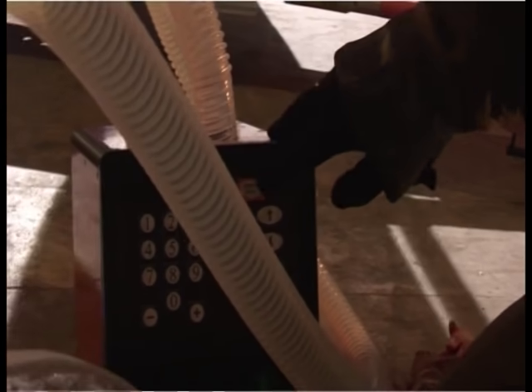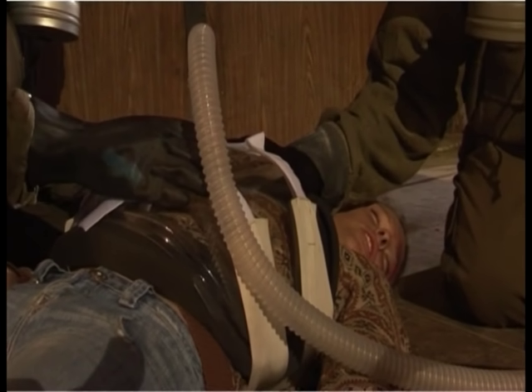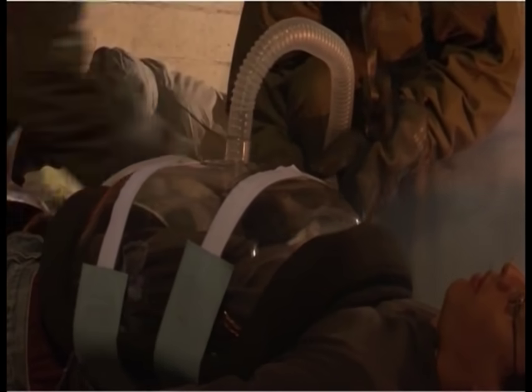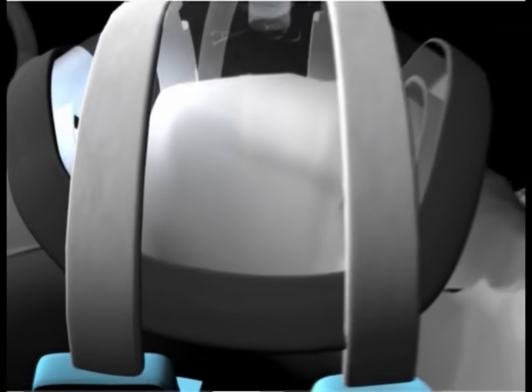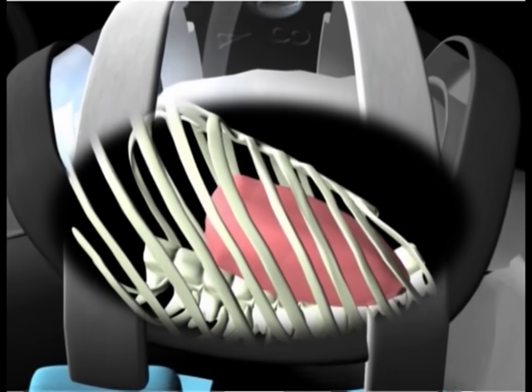The attached power unit actively controls both the inspiratory and expiratory phases of the respiratory cycle. Biphasic cuirass ventilation works physiologically, operating externally by creating negative chamber pressure on the entire chest area, causing the lungs to expand and inhalation to occur.